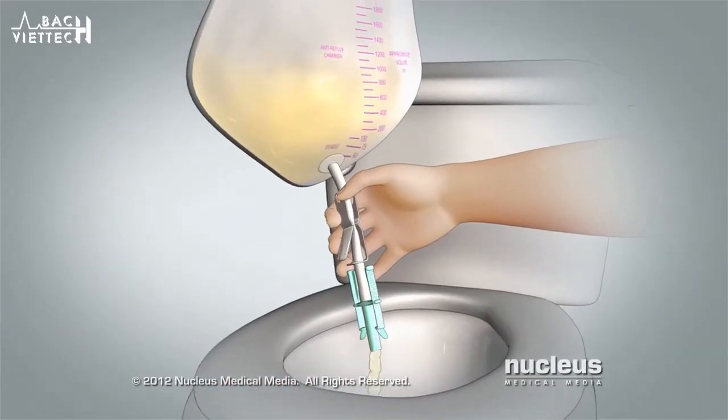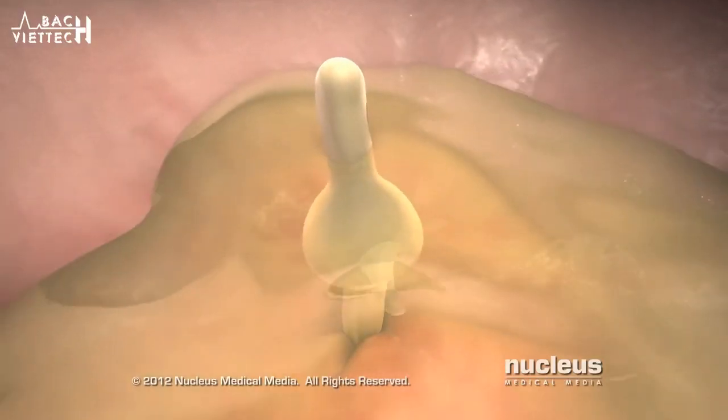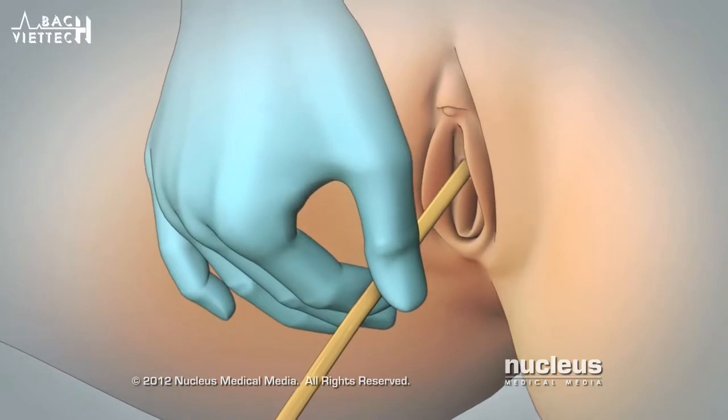Removing your Foley catheter involves emptying your Foley bag, deflating the balloon, and removing your catheter.